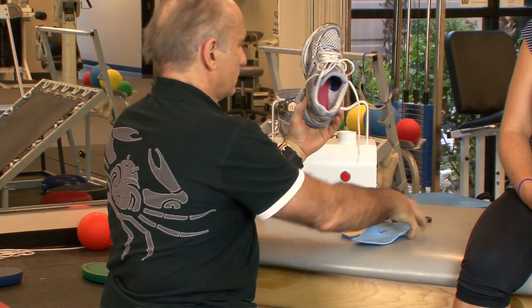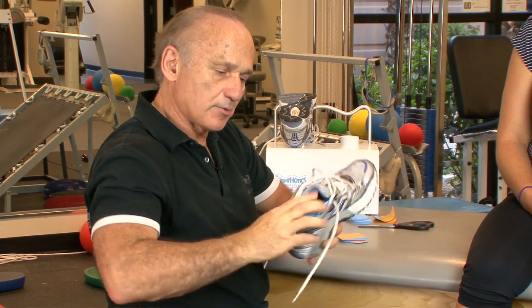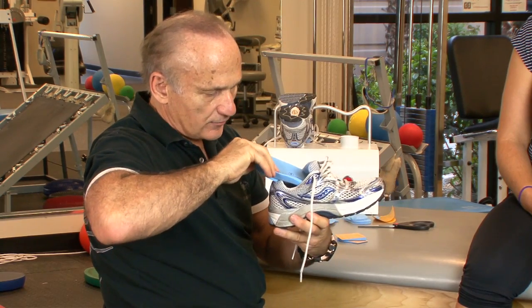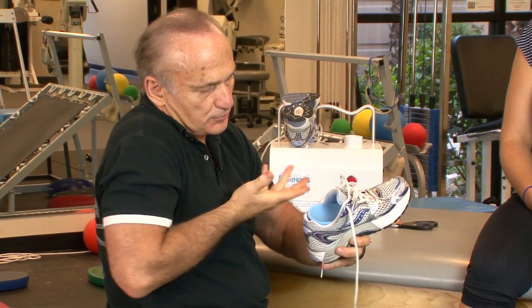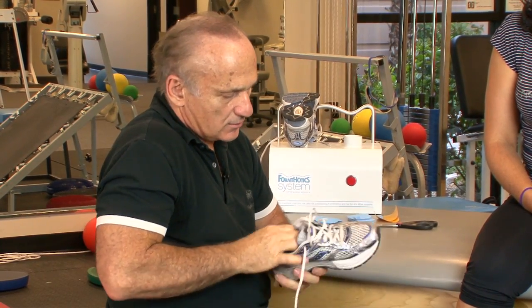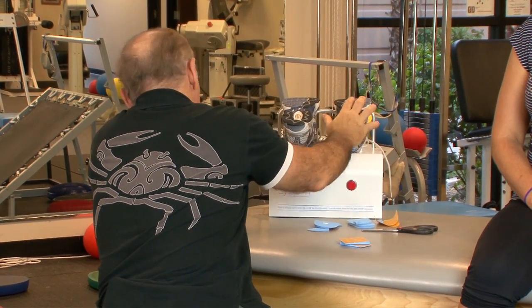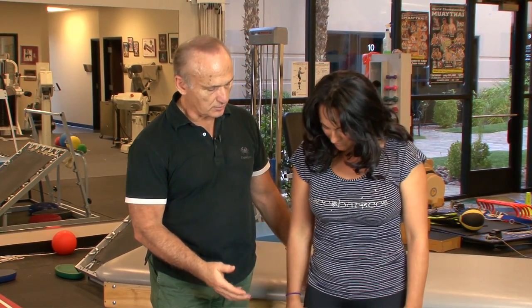Now we'll put them on the heating device. Be careful inserting them — don't put them in sideways. Sometimes I push them slightly forward and then down into the shoe for a nice snug fit — not loose. We heat them for three minutes, take them out, and then she tries them on and walks around. So we've fitted the orthotic, made the posts, put them in the shoes, heated them up, and now Georgiana has them in her shoes.